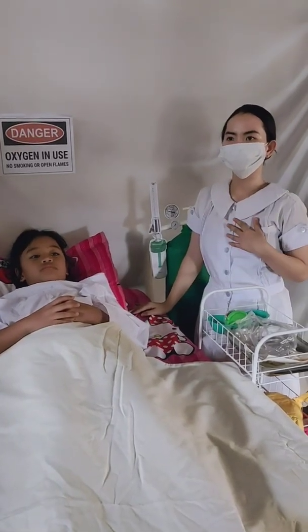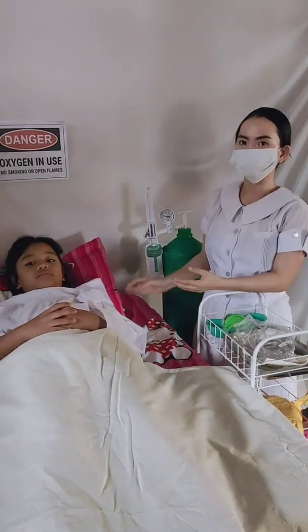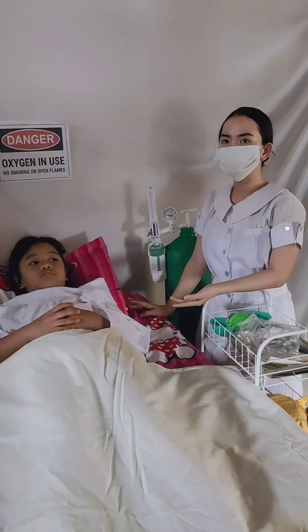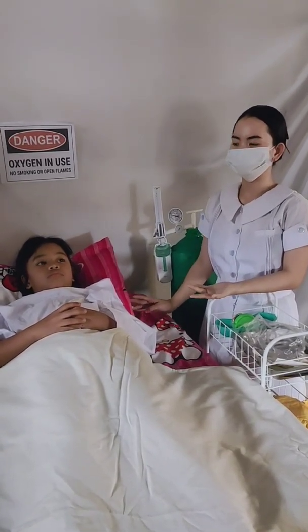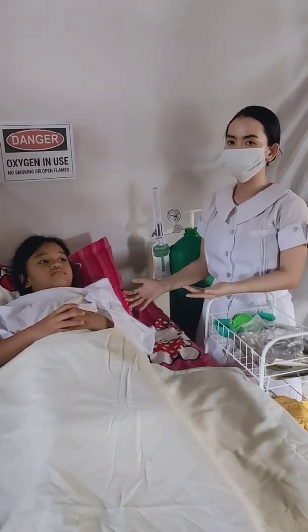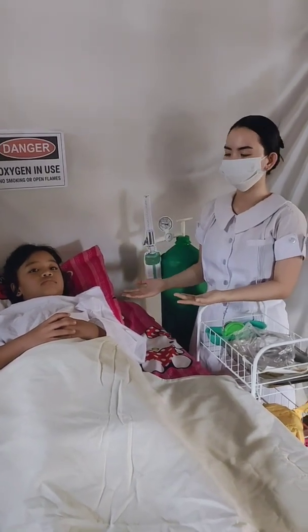Good day, I am Casey Anikdaw of BSN 3 and today I am going to perform oxygen administration by nasal cannula. Nasal cannula or prongs is used for low to medium concentration of oxygen, about 24 to 44%. The purpose of this is to allow uninterrupted delivery of oxygen while the client ingests food or fluids.